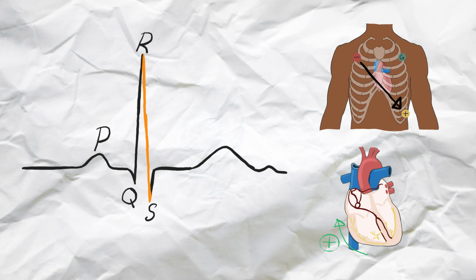Following this, there is a large downward deflection which results from the depolarization spreading up the Purkinje fibers. Remember that the recording from the electrodes is relative, and now that the charge is spreading away from the electrodes, this records it as a negative change. Once the wave of depolarization has finished, the cells need to repolarize, and this is seen in the T wave. Now, given that the previous depolarizations were positive deflections, we might expect that the T wave, being a repolarization, would be negative. However, because this negative wave is also spreading away from the electrode, beginning at the base of the heart and moving up, this makes it appear as a positive deflection.